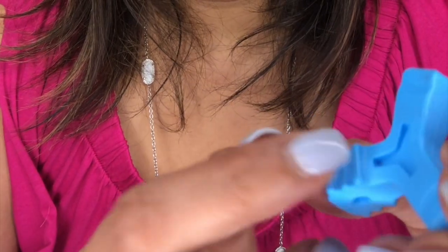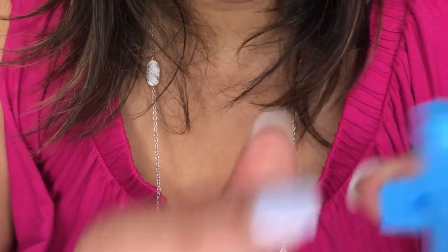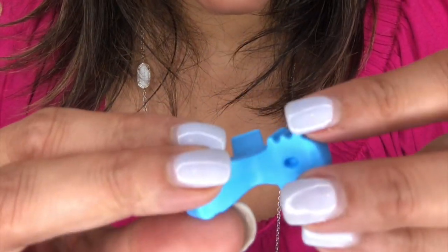Every time you put your aligner in, you want to use your Munchie about 10 to 15 seconds just to really seat it. So if you're in the second half of your treatment and I've given you a blue Munchie, or if you've eaten through the pink Munchie and I've switched you to the blue, same procedure — you're going to use the thicker slot for your upper teeth. One other difference you'll notice is on the opposite arch, there's another little indention which makes it a little bit more comfortable to bite into.